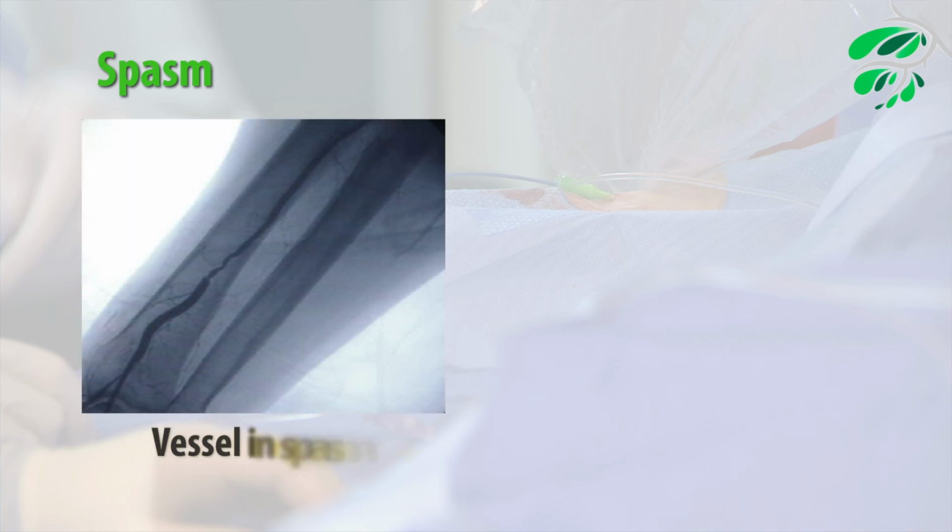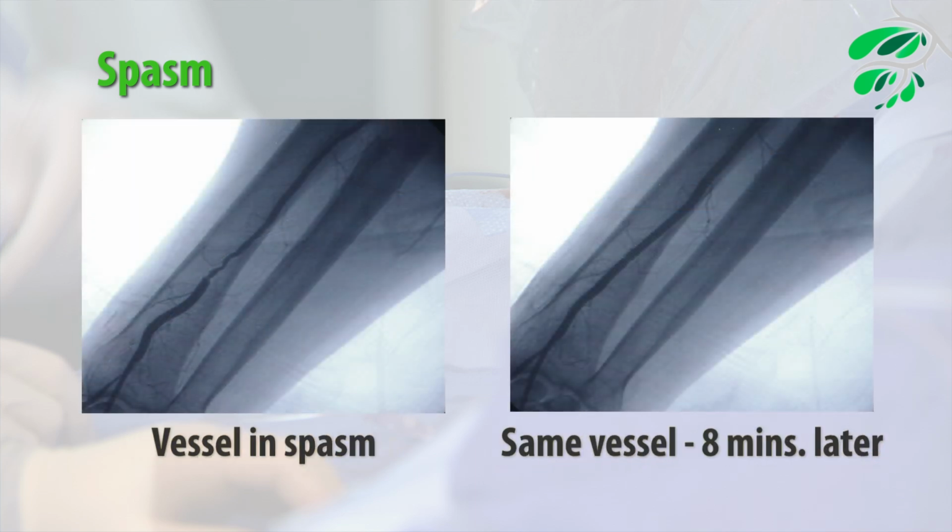But the thing that nobody talks about, that really, really works for spasm is time. And now, in the cath lab, 10 minutes is like 10 hours, okay? But really, spasm is cured by time. So even if you're using the right equipment, the patient's having spasm, you give all of your antispasmodics, they're still having spasm, sedate the patient, make sure they're comfortable. That helps. But sometimes you just need a little time. Step back, walk away, let the patient relax, let the artery come out of spasm, and you will be able to proceed with the case.